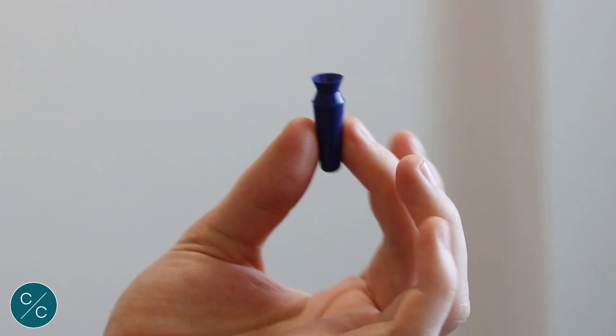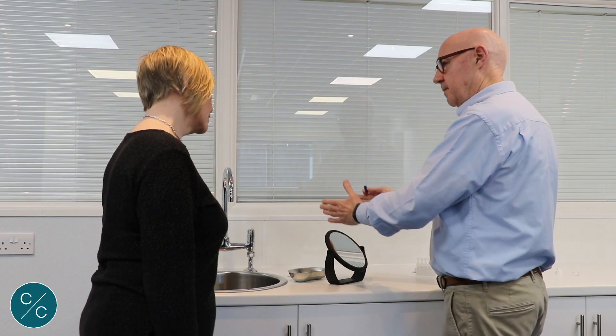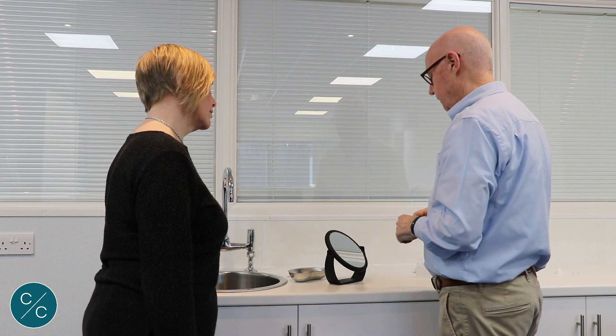Okay, so we're going to come to remove the lens, again making sure our hands are clean first of all. We're going to use a sucker. We're going to take the sucker and lean forward — this time the mirror can be at 45 degrees or even vertical if it's more convenient.